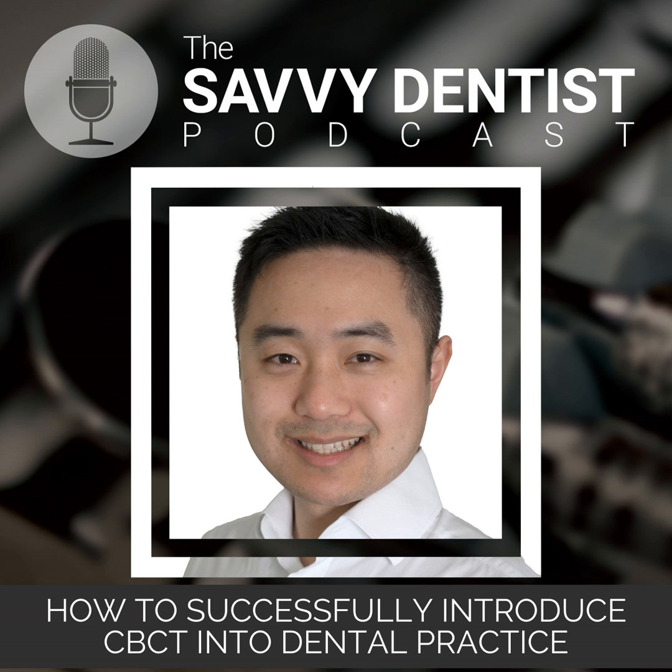set. So this is where I would say, if you are taking pictures, make sure you just cone that field of view into the area of interest. So if you're doing endodontic planning, you just need a 5x5 field of view to look at those few teeth. Don't take more images than you need, because if you do, you will inevitably see more and you will pick up more things, and that is actually your responsibility. Wow. But having said that, there will always be situations where you just can't avoid that. Like, if you're assessing for wisdom teeth, you're taking the maxillofacial range, assessing all 4 quadrants. You will see a lot more.